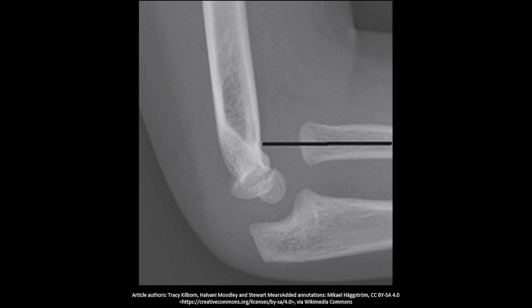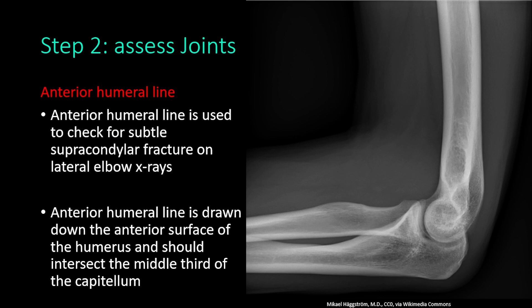In this abnormal example of a lateral elbow x-ray, the radio-capitellar line does not intersect the capitellum, meaning there is a radio-humeral joint dislocation. There is also an ulno-humeral joint dislocation and a radio-ulnar joint dislocation in this patient.